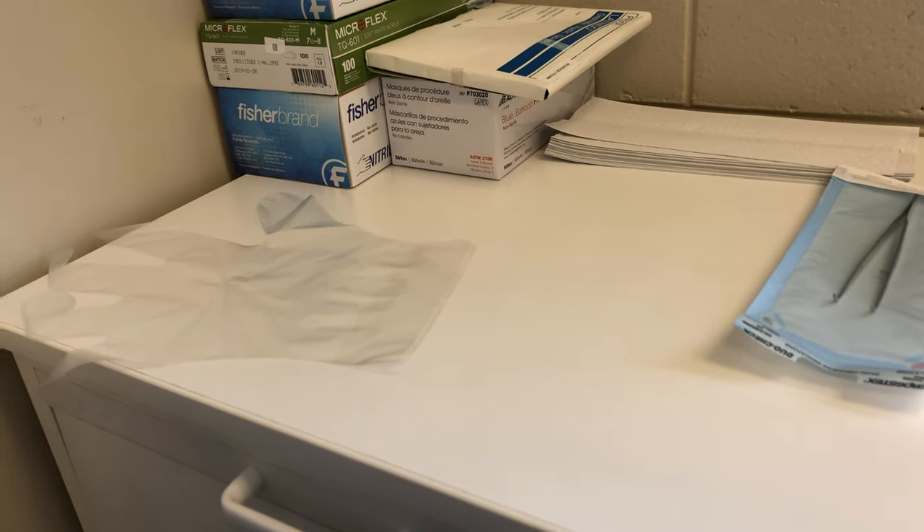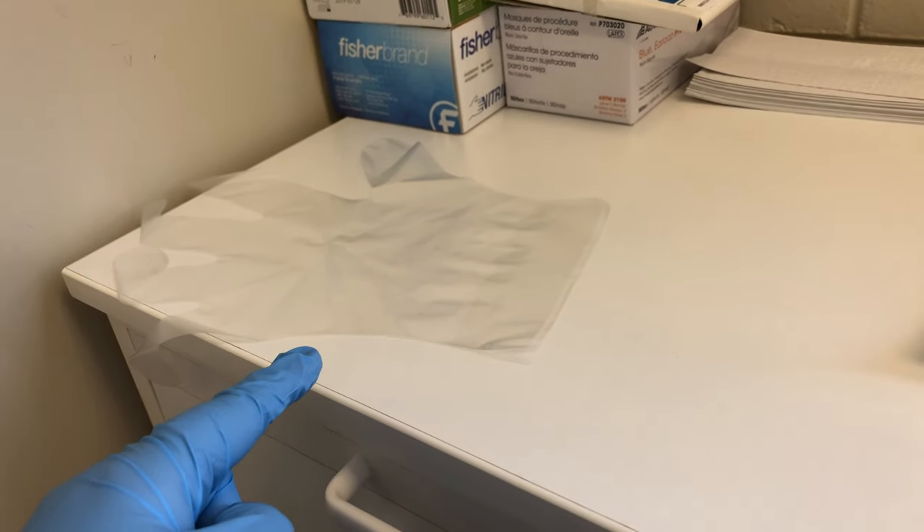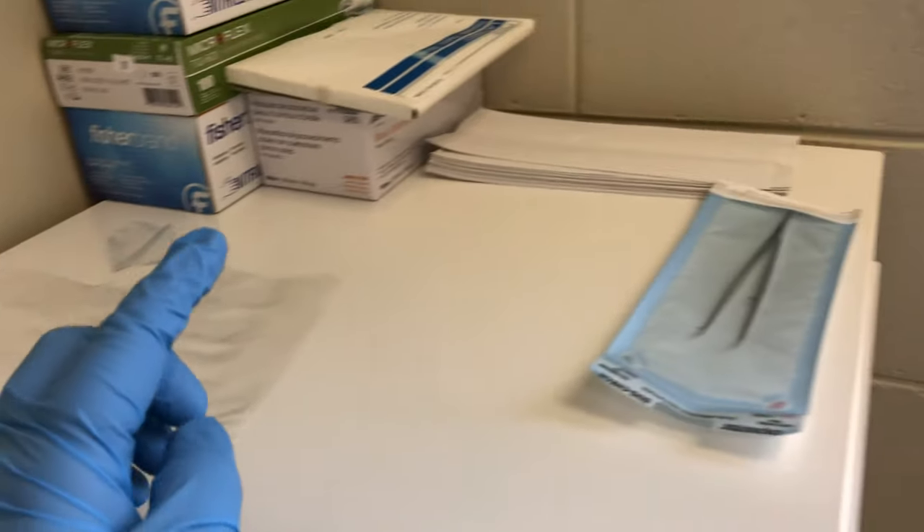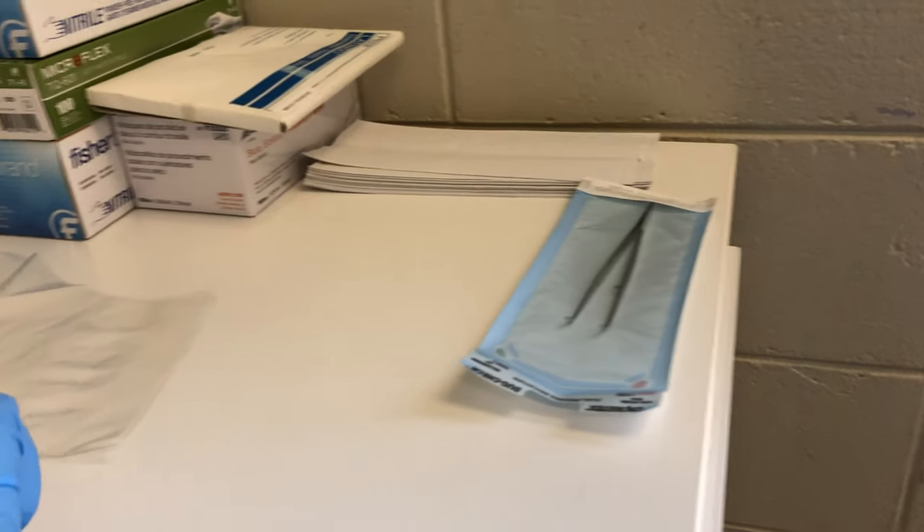The better options are to use an overglove — though some offices don't like purchasing these as it's an added cost — or you could use a sterile cotton pliers.